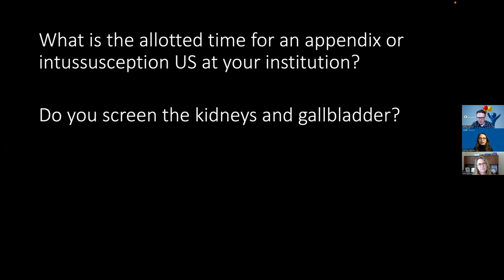And do you usually have a combination, especially in the females with right lower quadrant pain, something that involves both the appendix and the ovaries, like a pelvic ultrasound?